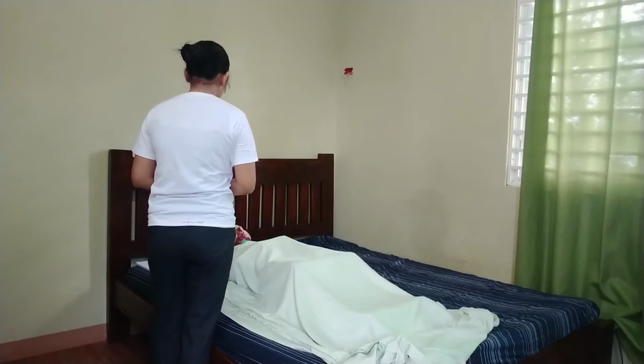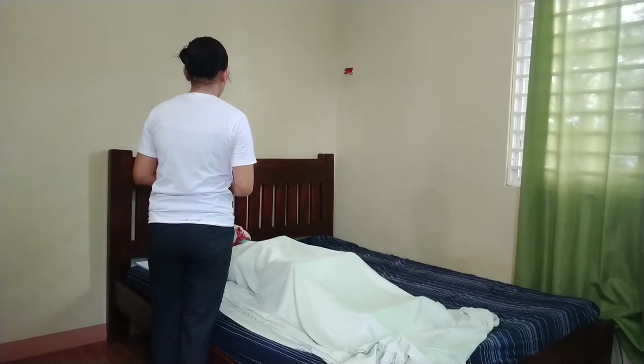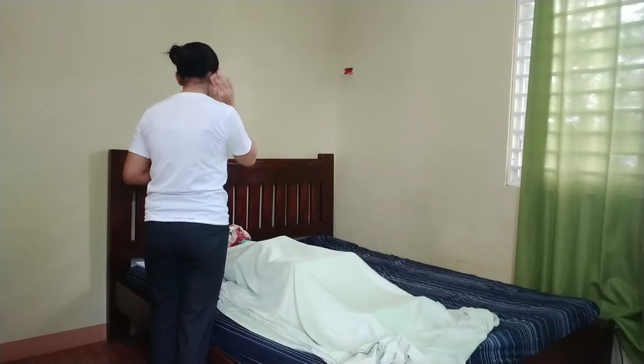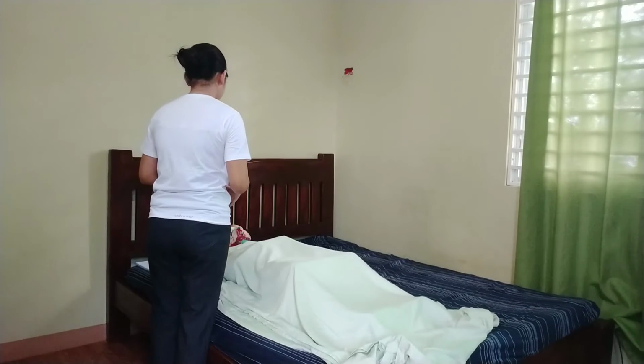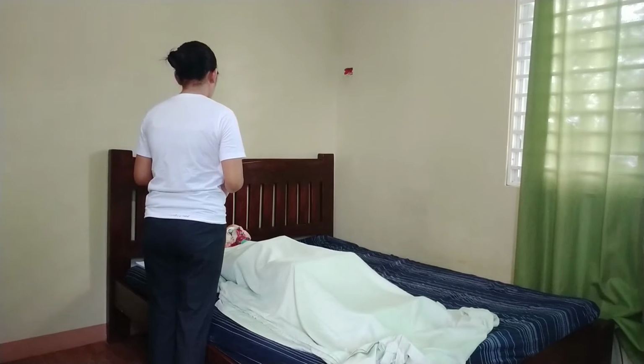Good morning, ma'am. May I know your name po? Okay, Mrs. Smith. How about your age po? Okay, thank you. So I am Principal po, your student nurse for today, and for today po, I will be doing a perilite exposure on your perineal area. So this is to provide comfort, to increase your blood circulation, and to provide you a faster wound healing. Will that be okay, ma'am?